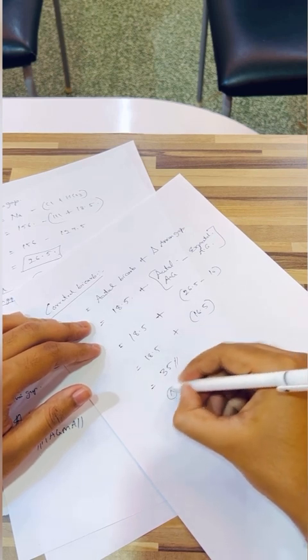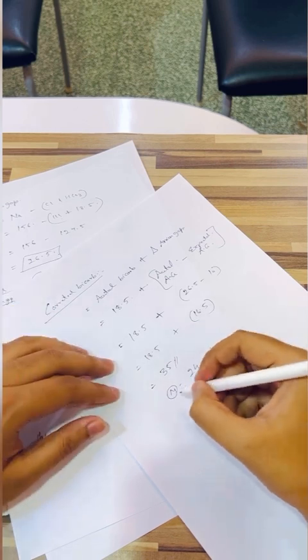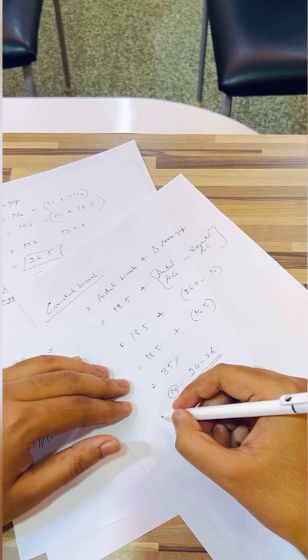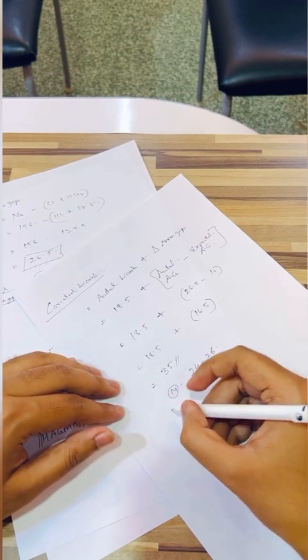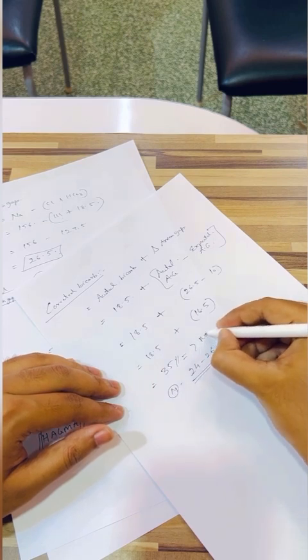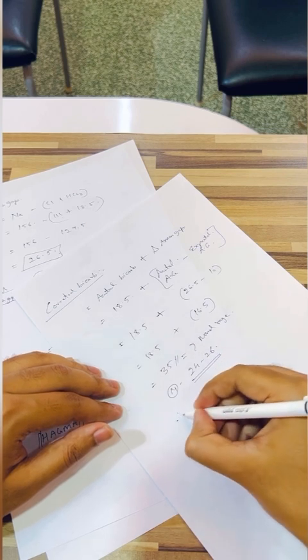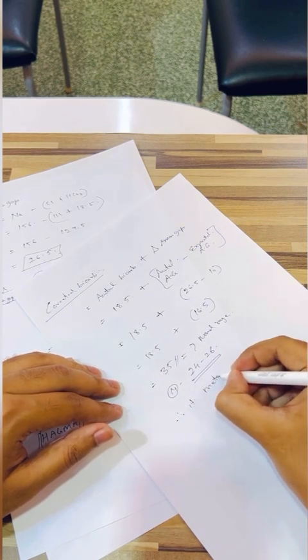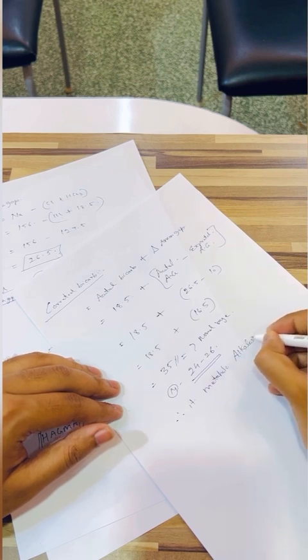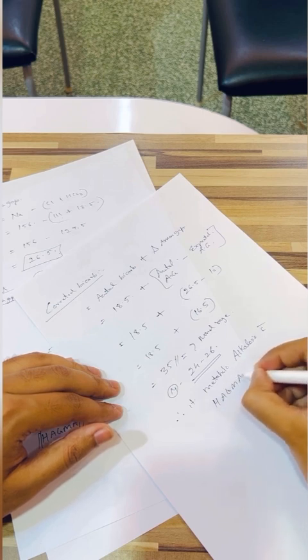The normal range for the corrected bicarb is 24 to 26. But in this case, for this patient, what we have got is 35. So obviously this is more than the normal range. So therefore it is metabolic alkalosis with high anion gap metabolic acidosis.